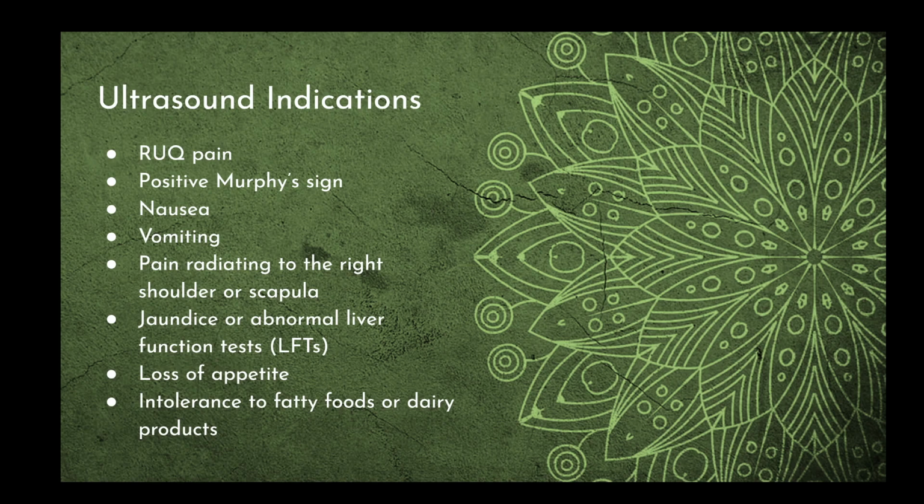And so again, we'll learn about it in pathology, but a positive Murphy sign is where, and we do this with ultrasound, we place the probe right underneath the rib cage, right over the gallbladder. And we ask the patient to take a big breath in. And as they take that big breath in, we're going to put some pressure down. And when that gallbladder slides underneath the pressure of our probe, and we're going to watch it slide, if they catch their breath and stop breathing, that's a positive Murphy sign. That's because touching that inflamed gallbladder really hurts. So they're going to jump a little bit. That's a positive Murphy sign. Sometimes people just say, oh, it hurts over there. And it's because you're on their rib or they're being wussies about it.